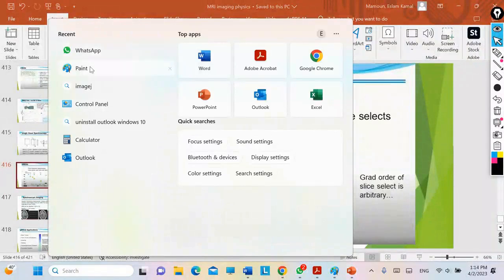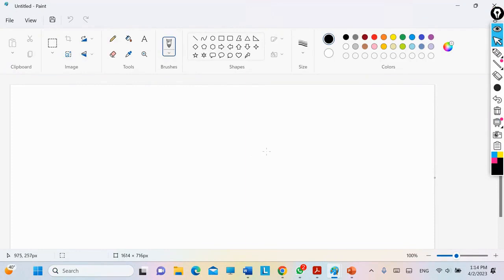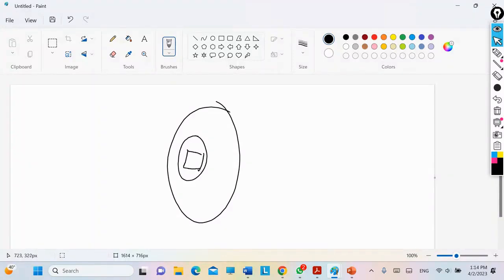First, am I dealing with pixels or voxels? I currently have this brain, and there is a tumor, and I want to measure the metabolites present in this area. Am I treating this image as 2D or 3D? Am I dealing with it in the X plane only, or in the X, Y, and Z planes? I still have to treat these pixels as if they are voxels in the X, Y, and Z dimensions. This is the Y, this is the X, and this is the Z.